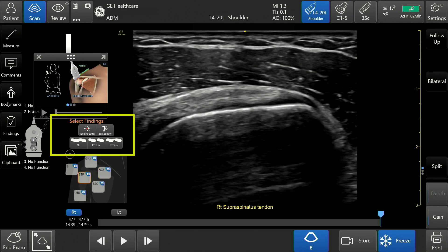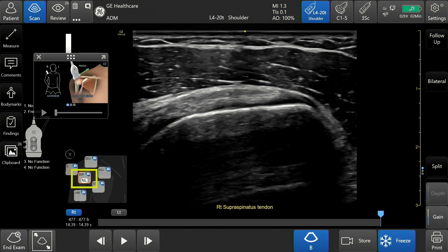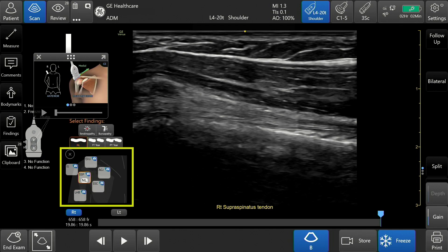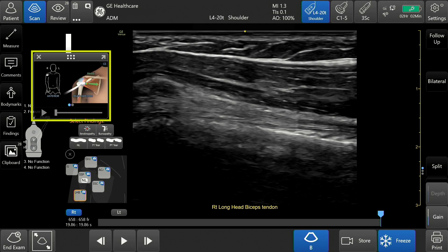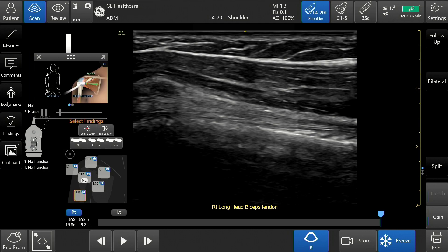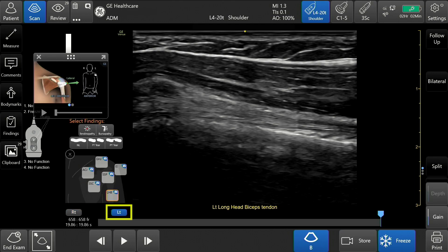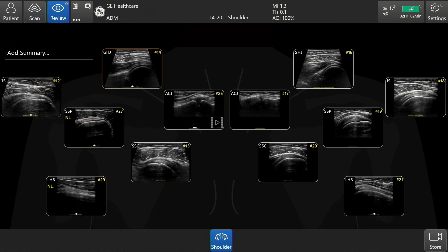A list of findings will appear on the left. Tap the desired finding to label that zone. The label will appear on the stored image. When an image or video clip is stored, a camera icon will appear in the selected anatomy on the shoulder diagram. To switch to the graphics display and video, tap another view on the shoulder diagram. Once scanning is complete, the shoulder diagram provides a simple and fast tool to help with image labeling for documentation and patient follow-up exams.